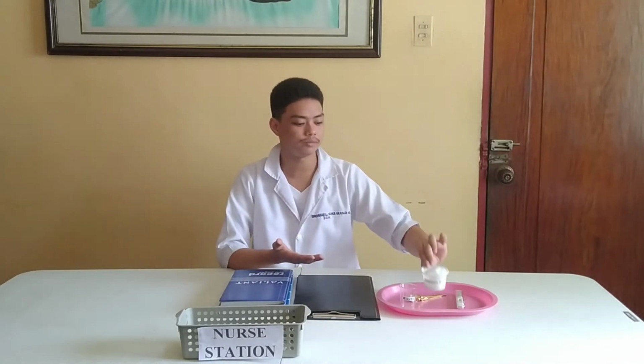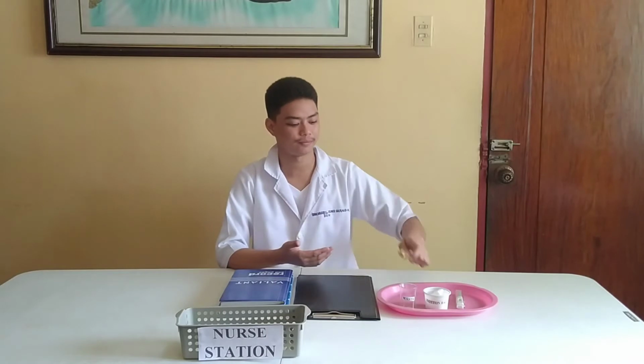For the planning, we will need to assemble the equipment and supplies that we will need in these procedures. For assessing the temperature, we need a thermometer, a pair of gloves if necessary, tissue, wipes, or cotton balls with alcohol. For assessing the respiration and pulse rate, we need a watch with a second hand or indicator.